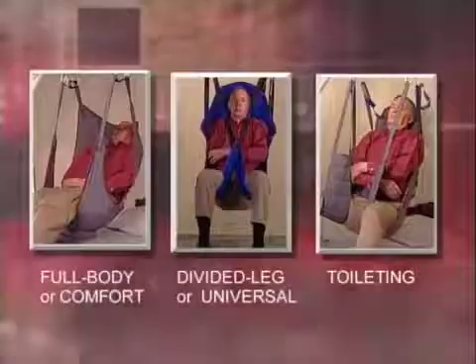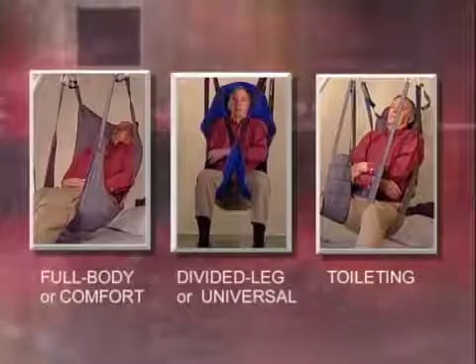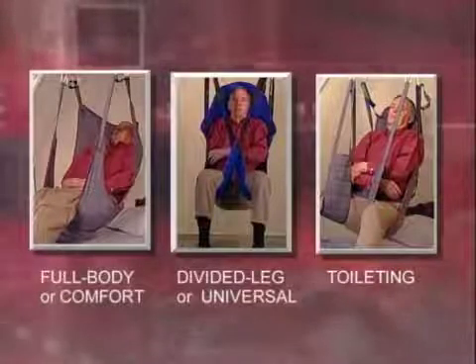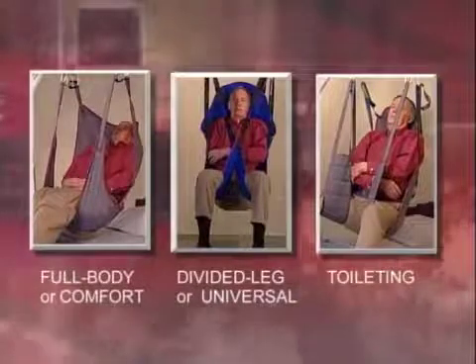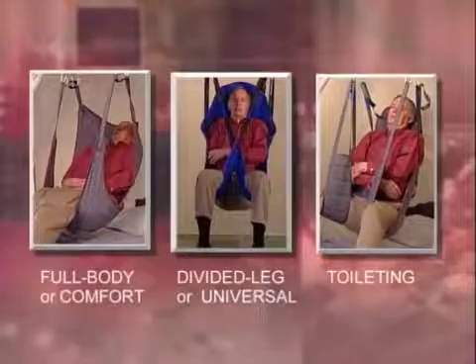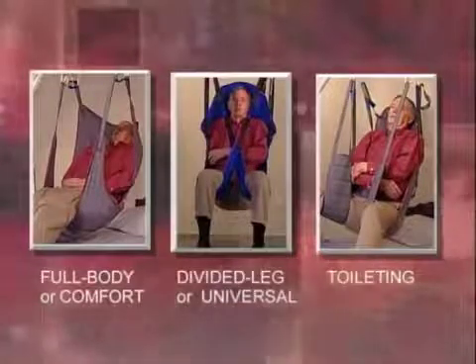Generally, slings fall into one of three categories: full body or comfort, divided leg or universal, or toileting slings. The full body and divided leg slings have built-in headrests for patients with limited stability, and the full body sling has an optional commode opening. The divided leg and toileting slings fit around a seated person and provide added comfort with padding under the thighs.